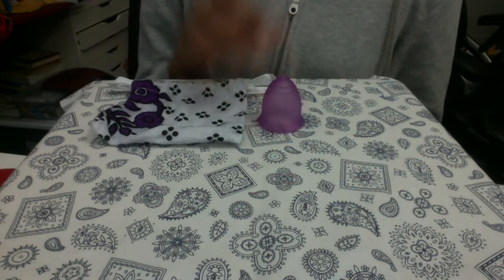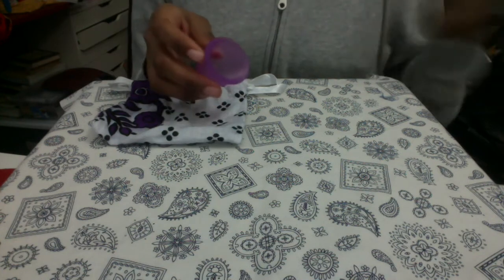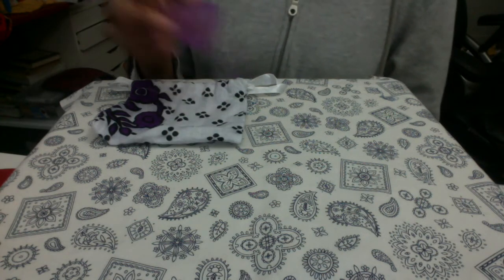So for me, the Ruby cup is kind of my light cup. It's equivalent to me of a light tampon, which I wear on my light days. So I wear this cup when I know that I will get the full 12 hours out of it. So I know I will be able to insert when I leave home and then only need to remove it when I get back home.